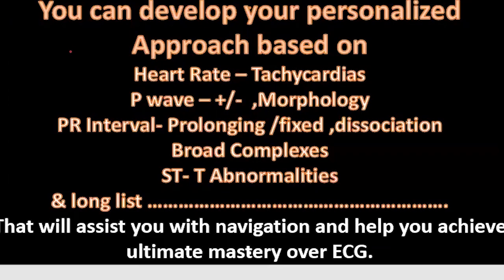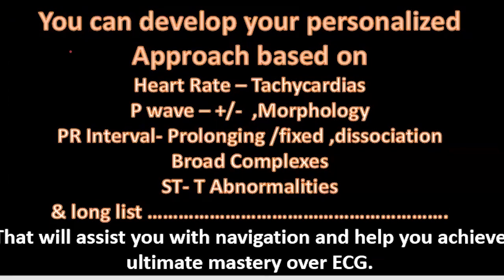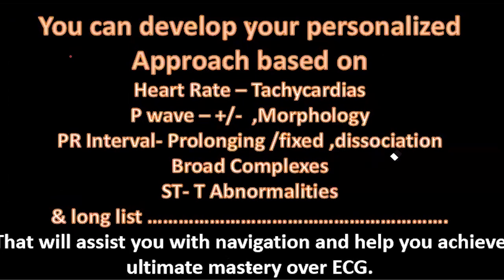You can also develop your own personalized approach based on the heart rate, whether it is tachycardia or bradycardia, P wave absent or normal, based on the morphology, based on the PR interval, whether prolonging, fixed, or there is a dissociation, as in complete heart block, on the basis of broad complexes, on the basis of dropped beats, on the basis of ST-T abnormalities, and a long list is there to approach. That will assist you with navigation and help you achieve ultimate mastery over the ECG.